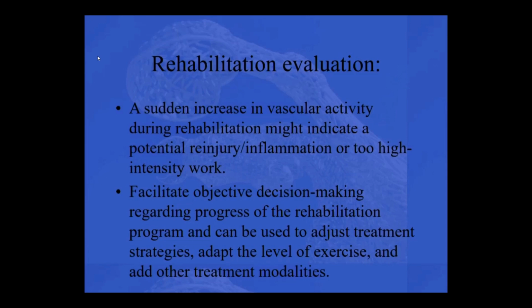So it helps me at least in my practice a lot in making decisions for where my next step is. In general, I work with protocols. I see those horses back every 2 months, but you have a status quo at that moment to see, can we proceed to the next phase, or do we have to make some little adaptations? My power Doppler is a great tool to see if my amount of inflammation, if you might simplify that, is going down when my power Doppler activity is going down.